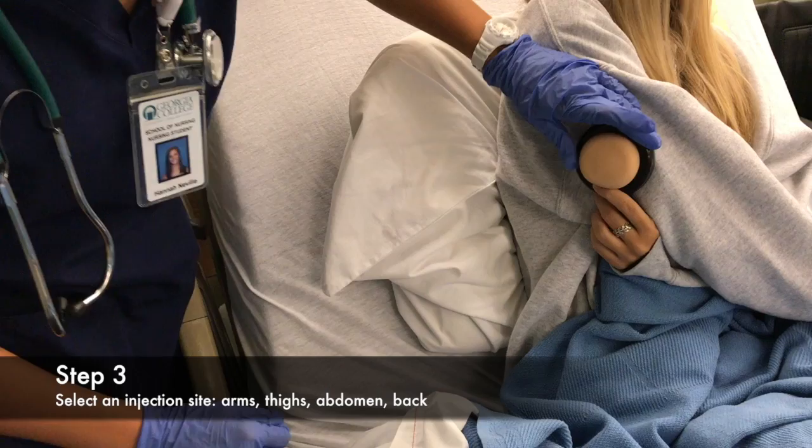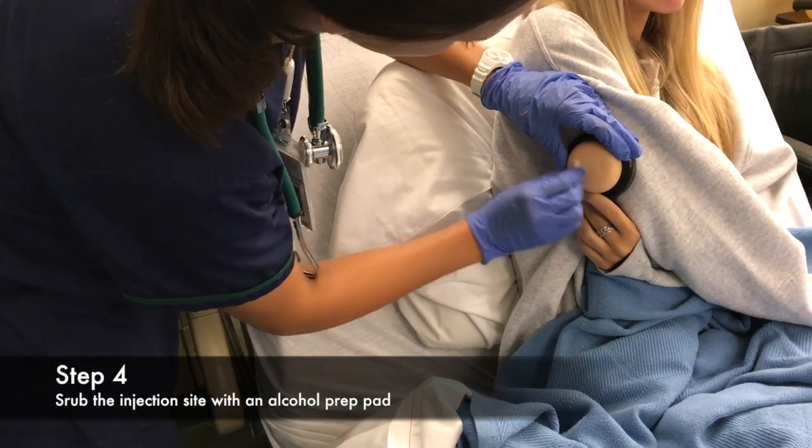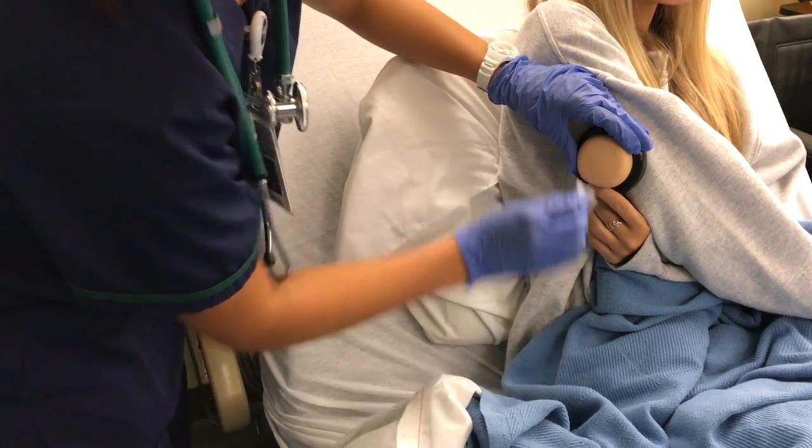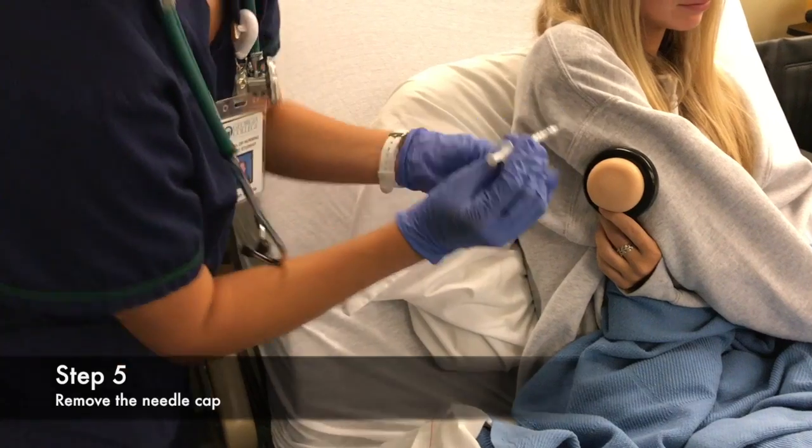Select an injection site. Scrub the injection site with an alcohol prep pad. Remove the needle cap. With your non-dominant hand, pinch the tissue at the injection site and determine the angle at which to inject the needle.